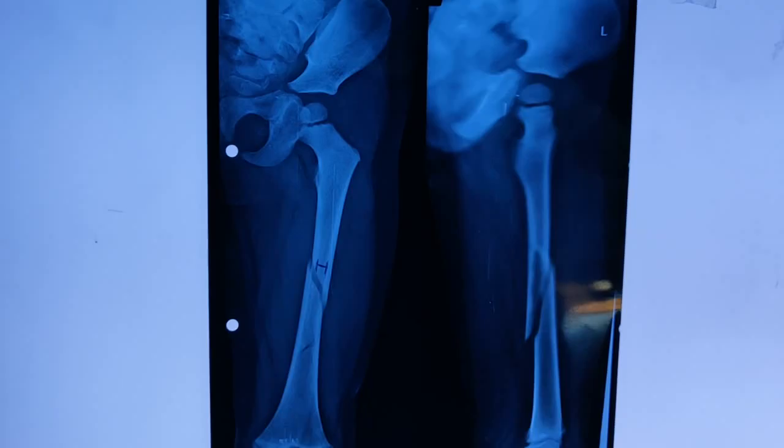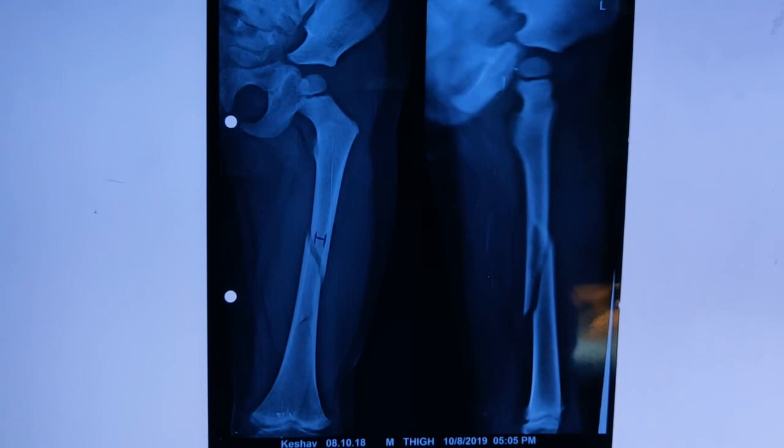Hello viewers, today I'm going to demonstrate a surgical operation called TENS nailing. This stands for Titanium Elastic Nailing System. This is usually performed for the pediatric population, and today's surgery is in a pediatric patient who has got a femoral shaft fracture.